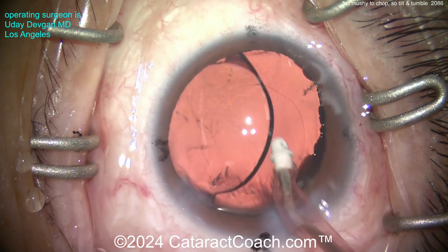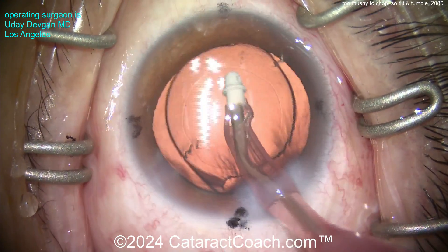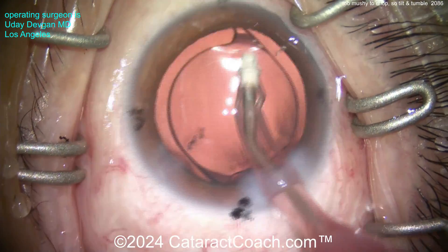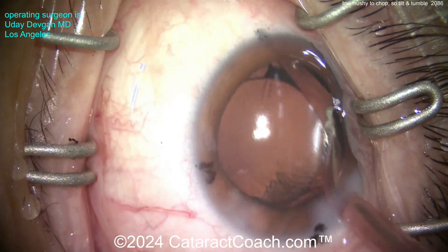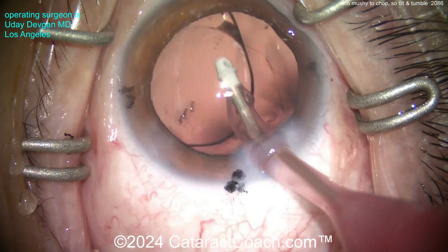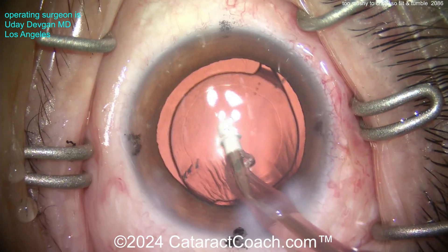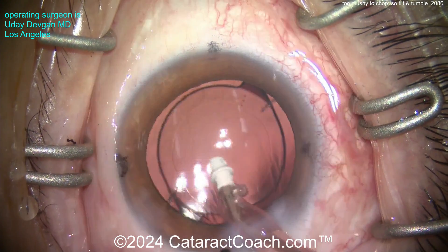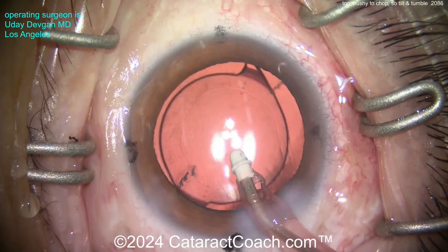With a toric lens it's obviously very important to remove the viscoelastic from behind the optic - you want that optic sitting directly on the posterior capsule. These hydrophobic acrylic lenses tend to be slightly tacky and they'll stick kind of where you put them. So taking out all that viscoelastic from behind the optic is important. Then we'll get the lens lined up at the correct meridian position.